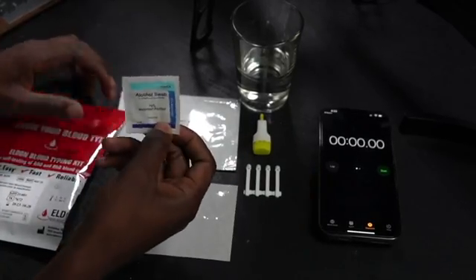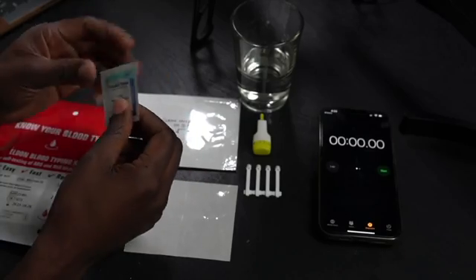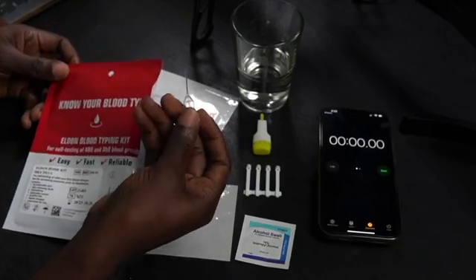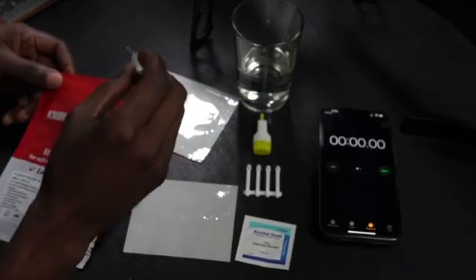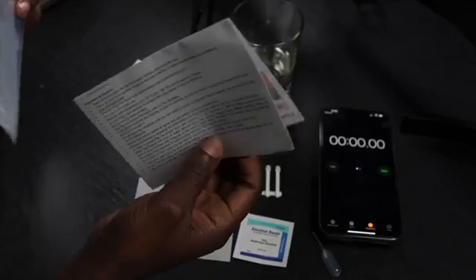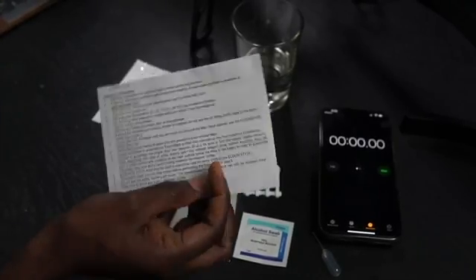Then we have an alcohol swab to sterilize your finger before we puncture the skin. And then we have this little plastic pipette. This is what we're gonna be using to put little drops of water on the card. And the last thing we have inside are the instructions. We don't need these instructions because I'm gonna show you how to do it, but I do recommend for you to read the instructions if you're doing this yourself.